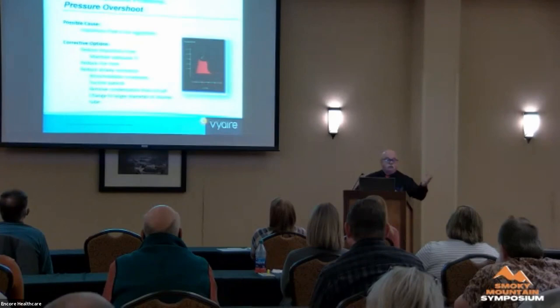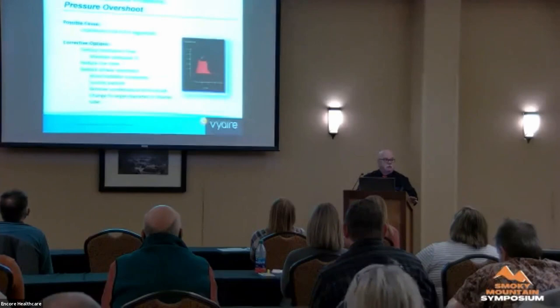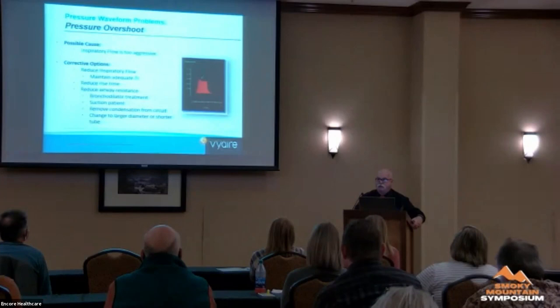So, possible cause of this: the inspiratory flow might be too aggressive, which means your I-time is too short. Corrective actions: reduce your inspiratory flow to maintain an adequate I-time. Reduce your rise time, which most vents now have an automatic setting for. What I'm teaching around the country, and I travel the country like crazy, these last 20 months: anytime you see an automatic option for your rise time, your termination time, or your flow trigger, pick auto. Let the ventilator work with the patient rather than dictate to the patient.